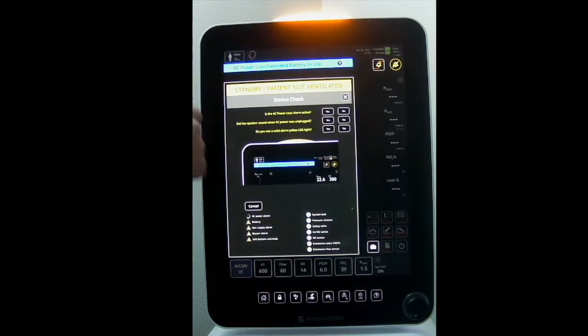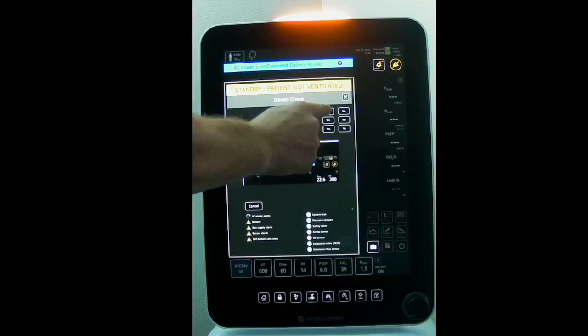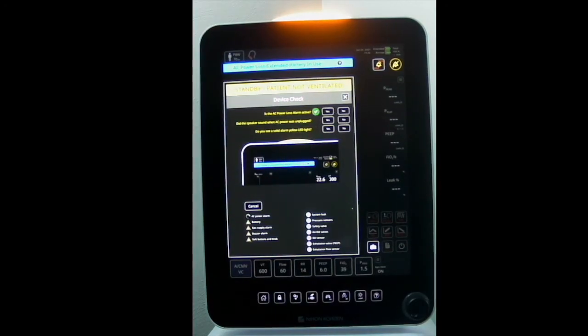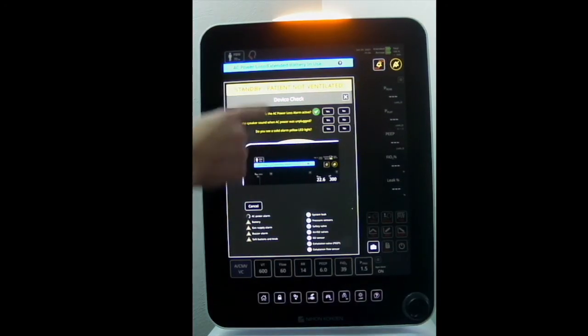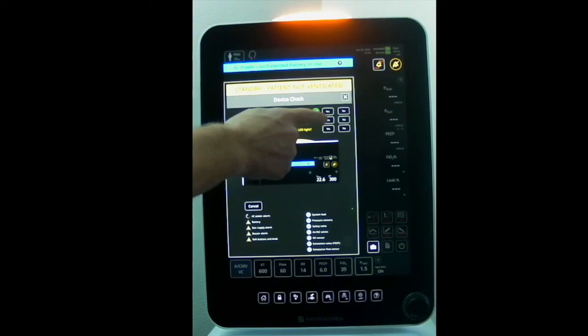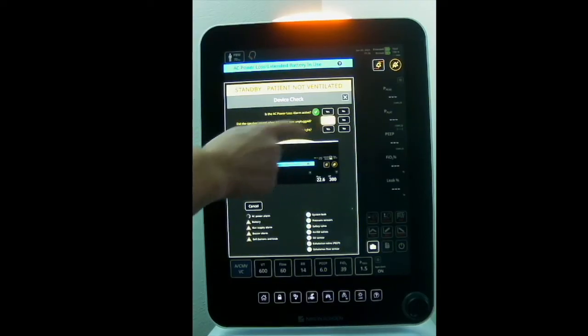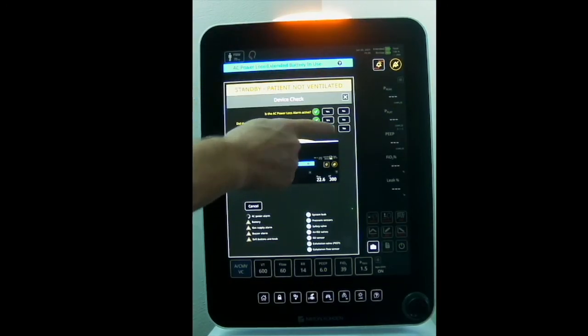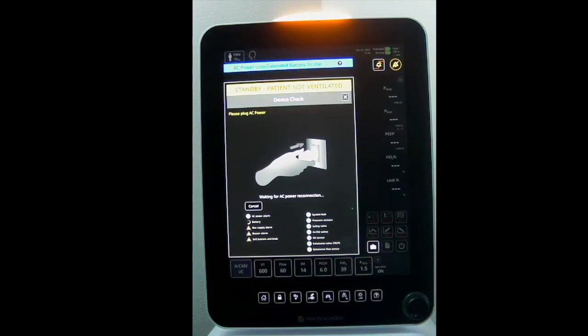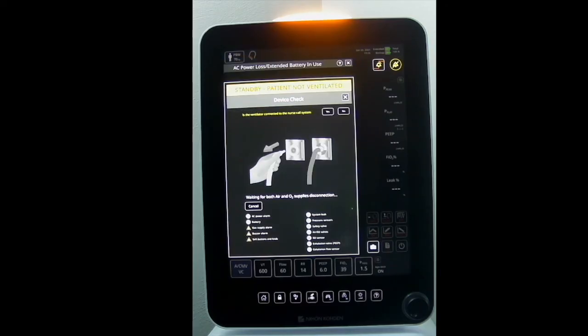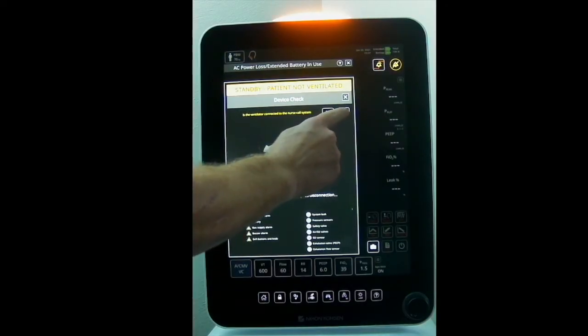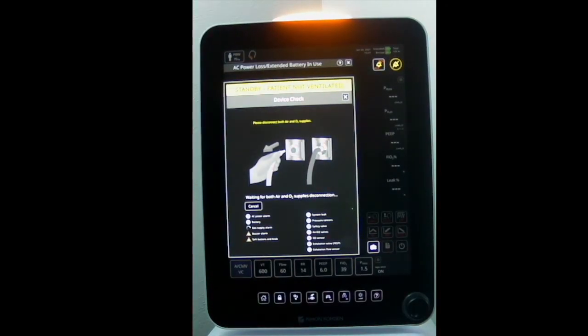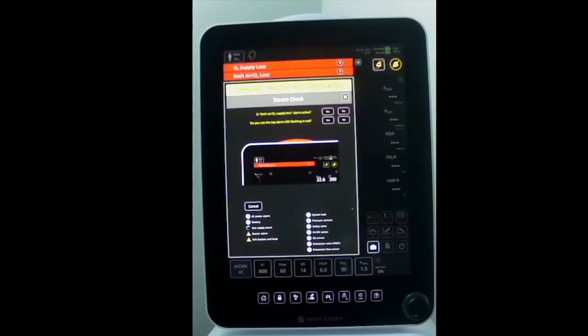Performing the alarms test confirms proper operation of the various alarms and the recognition of disconnect and reconnect for each item tested. You will be asked to disconnect and reconnect your AC power, extended battery, medical air, and oxygen gas supplies.